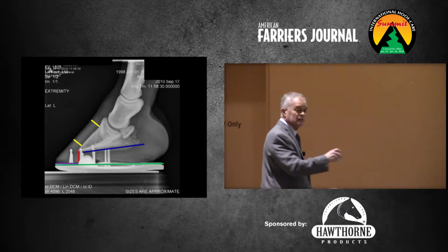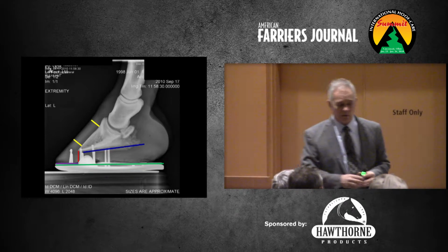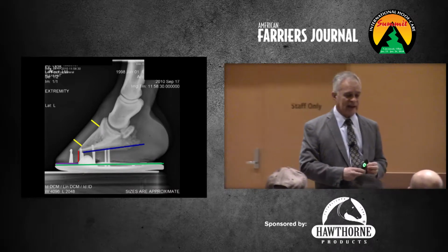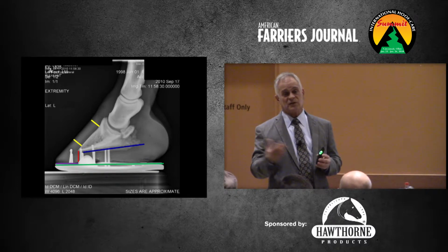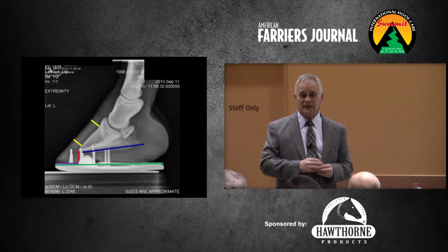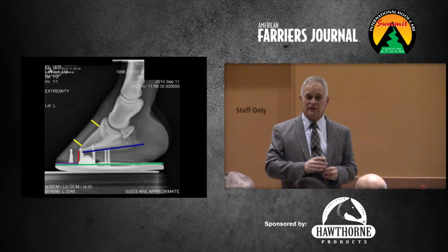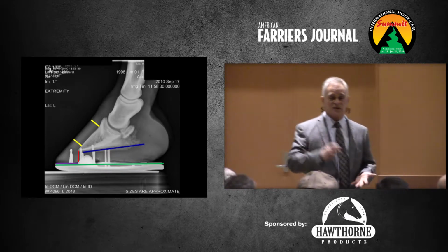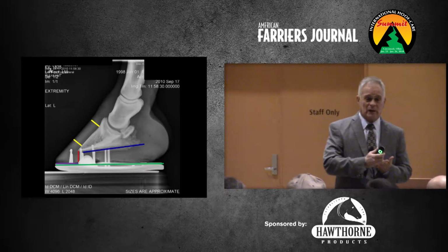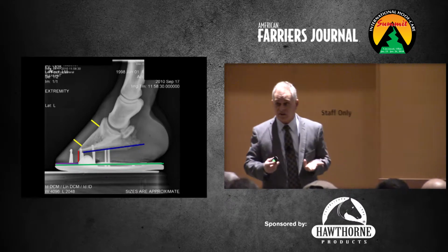The green here, the average. It's going to vary obviously between horses, but what we would use for the average sport type, pleasure type horse, after we trim it, we would like it to be around 15 millimeters, but in all reality, a lot of times it's like 12 to 15. Okay, you start getting less than 12 and they can get sore. Some horses are trimmed, our barefoot horses, we'd like a minimum of 15, up to that 18 to 20 millimeters is awesome.